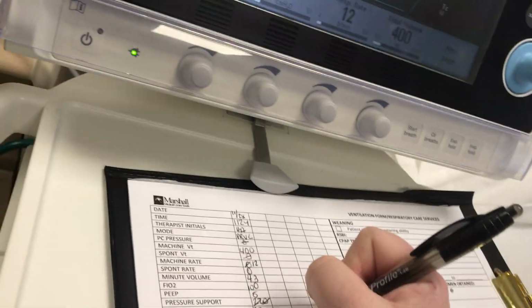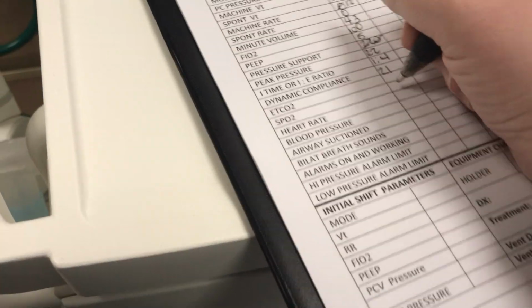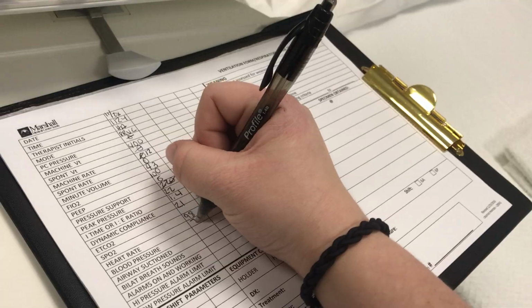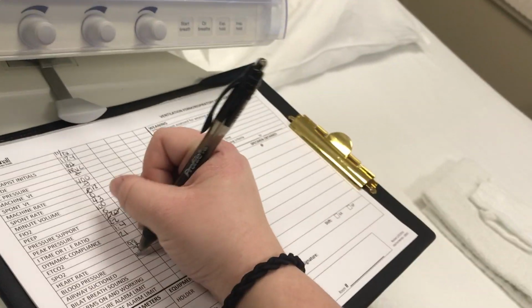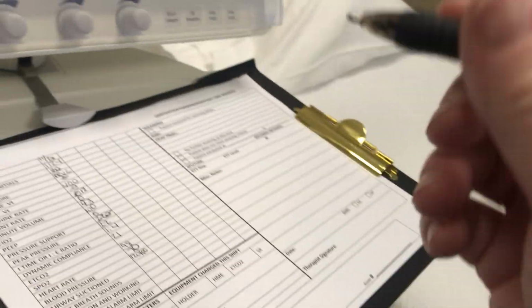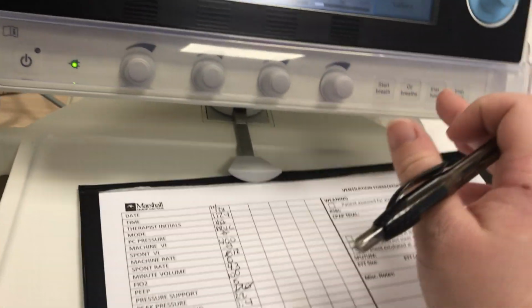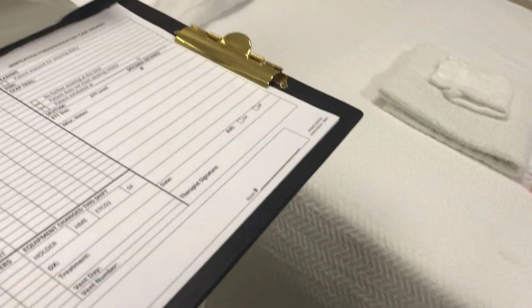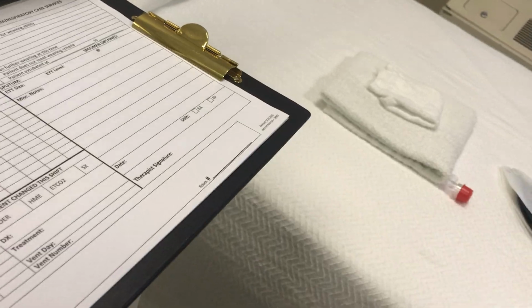I'd look at the patient vitals now: SpO2, let's say we're at 98, heart rate 70, 120/80. And then I would say if I suctioned the patient, because you would assess to see if you needed to suction them, of course. So let's say I don't have to suction that time, I would just put an X there.